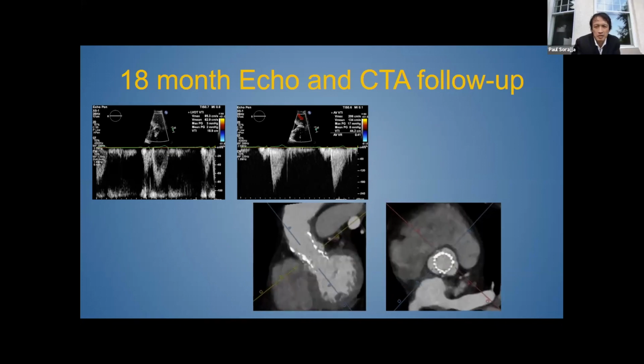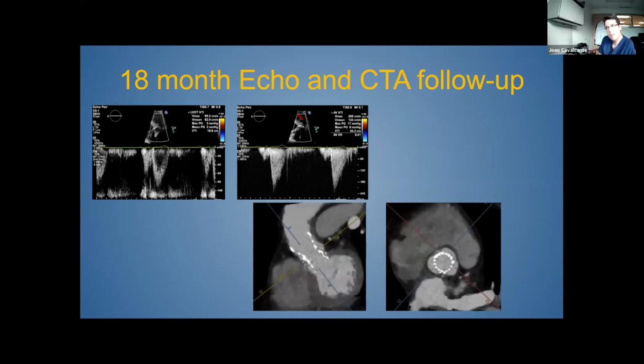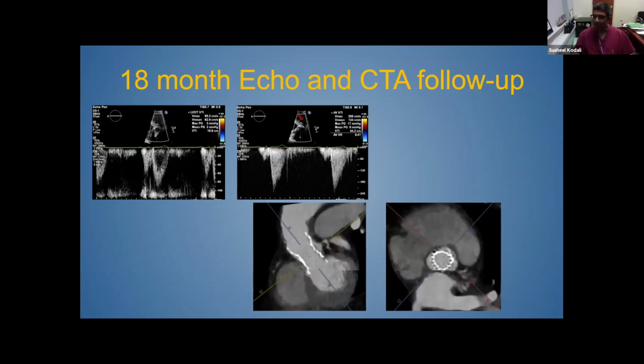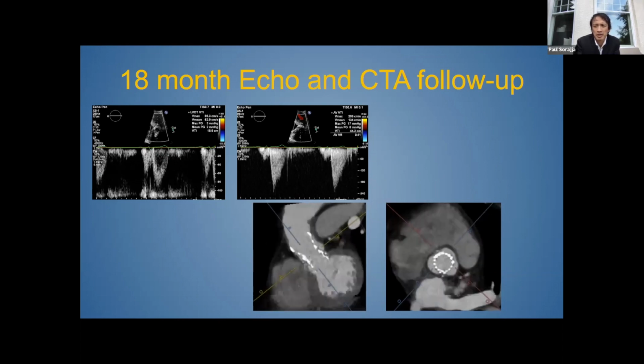This may sound like a crazy question, but would anybody consider post-dilating this valve now, knowing that maybe the expansion is not quite what you want to see, there's some hemodynamics, there's some halt? Would you consider post-dilating this in any way, doing BVR? I don't think so, because the Trifecta can't expand, right? The Trifecta is the one you can't fracture, but could you remodel though? Yeah, but how much do you think you would remodel there? And that's a question. Can you do BVR of the outflow? And would that help with some of the leaflet expansion?